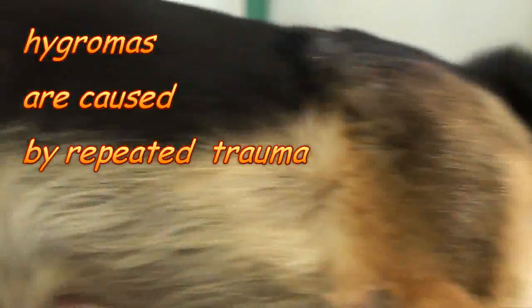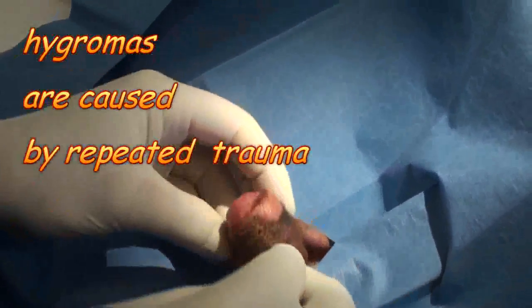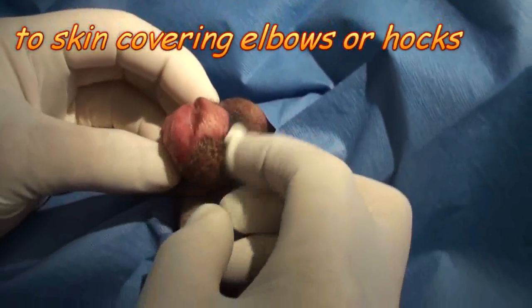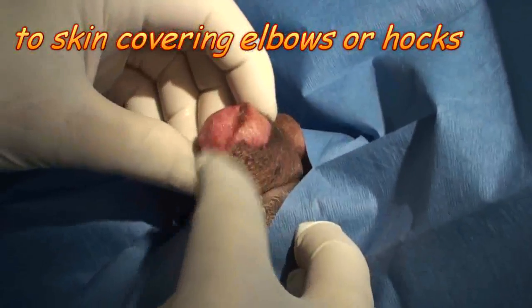I'm going to show you the callus or pressure point, then I'm going to show you how I take it off. This is the leg, all shaved up, and I'm going to put the drape over. Here's the pressure point — see, that's the hock joint. This is a big callus and the dog beat it up so much it ulcerated; it's a wound.